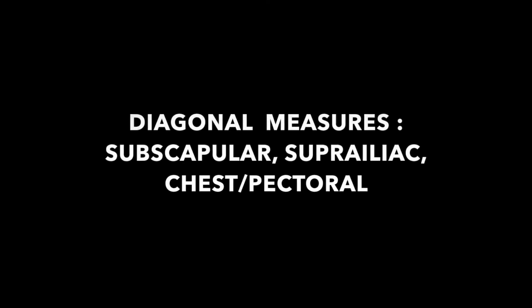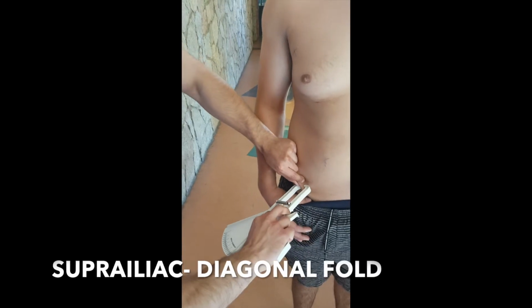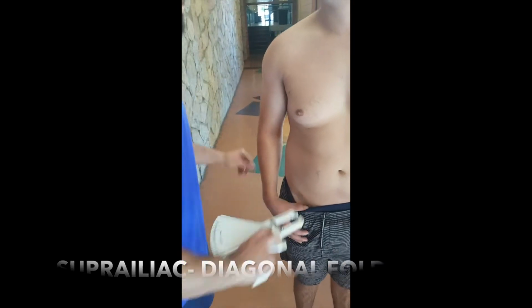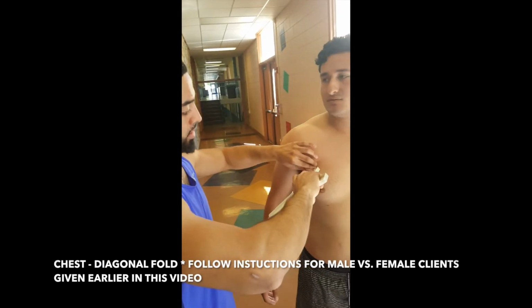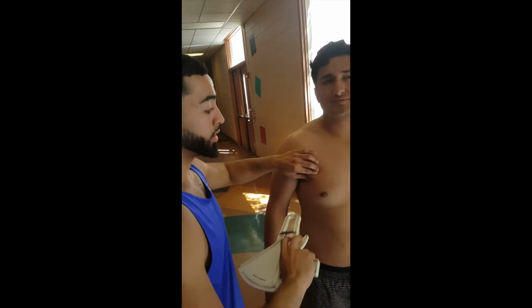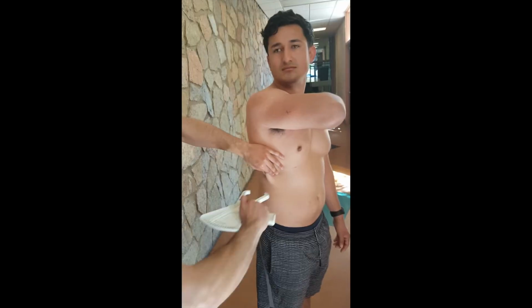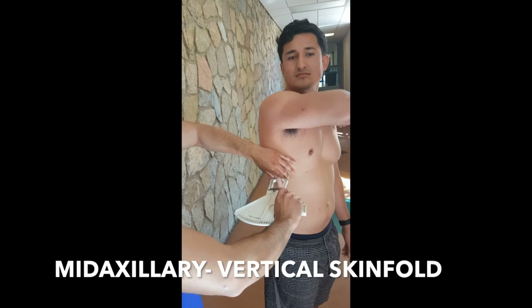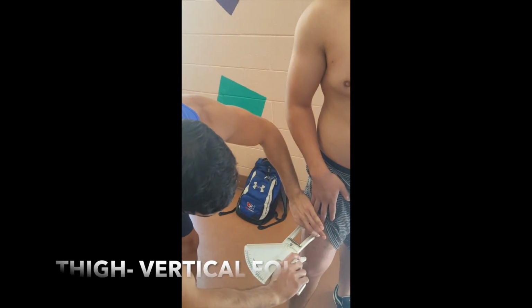The subscapular, suprailiac, chest or pectoral measurements will all be diagonal measures. Taking 2 measurements which will be averaged into the results for subcutaneous fat and body density. A retest will be required if measurements are not within 1 to 2 millimeters of each other. Be sure to rotate the 7 sites in case of a need for a remeasure. This will allow time for the skin fold to regain its normal thickness.